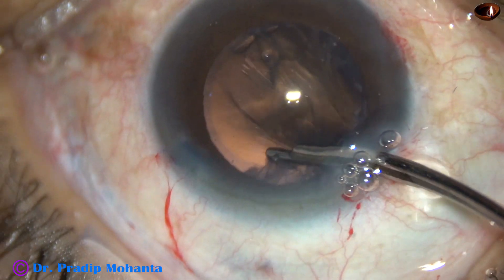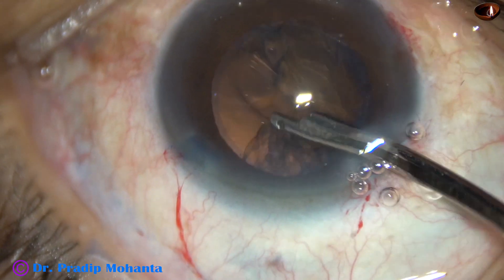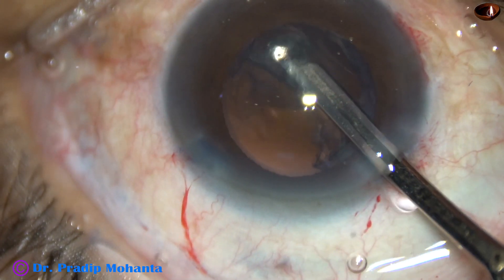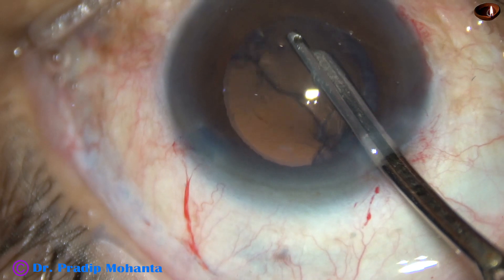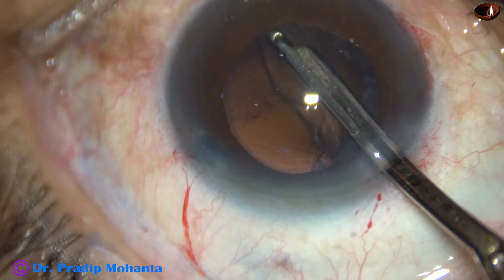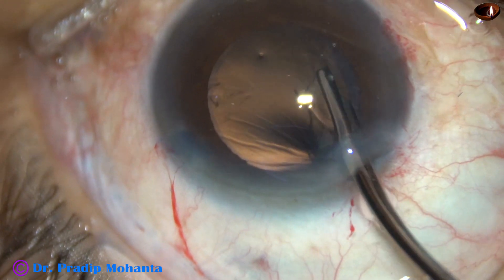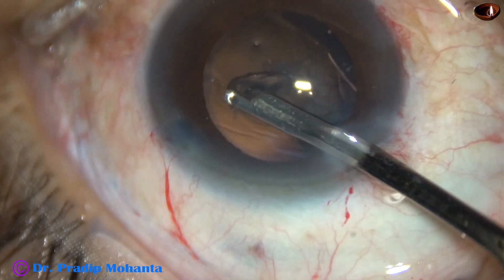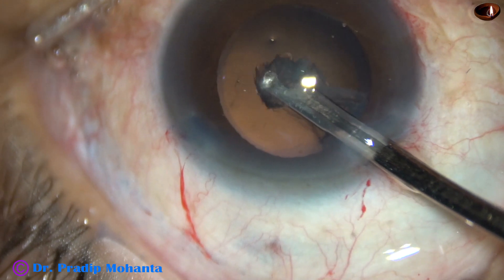And now in this case, I am using this Simcoe cannula for removal of cortical lens matter. Most of the cortex can be removed through the main incision. Side ports can be small — you don't have to go through the side ports.